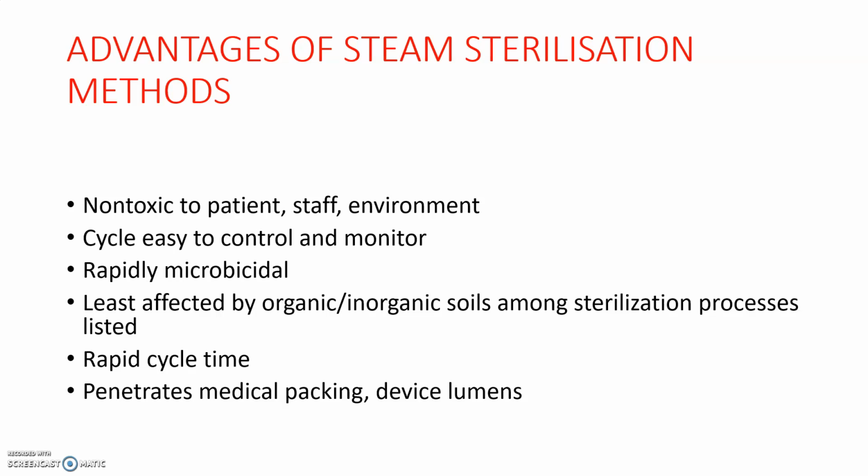Next is the advantages of steam sterilization. It is non-toxic to patient, staff, and environment, and the cycle is easy to control and monitor. It is rapidly microbicidal, least affected by organic or inorganic soils among the sterilization processes listed, has a rapid cycle time, and also penetrates medical packing and device lumens.